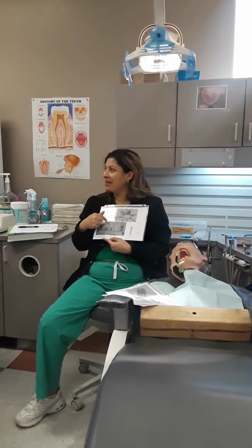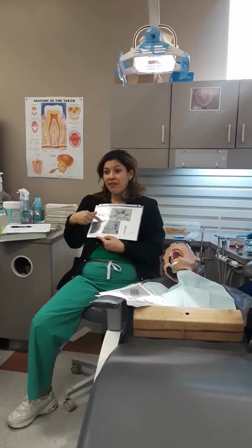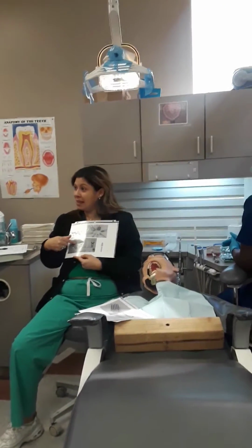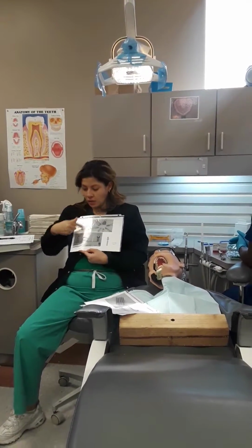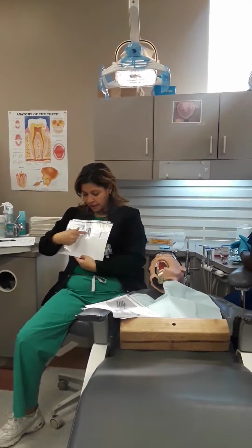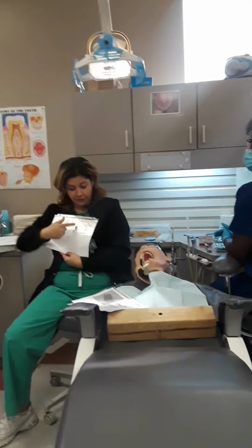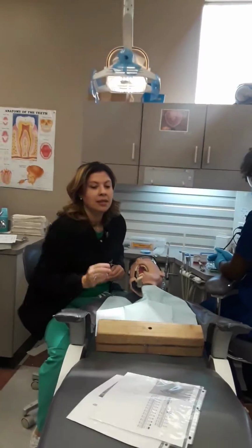polish the amalgam and make it smooth and slick, because if it was rough, then plaque and bacteria like to adhere to rough surfaces. So we would just place a filling that attracts plaque instead of not. So that's why we need these. Then I have examples of finishing strips. Also, again, different types of discs and mandrels. So you get them up close. I have a few pages of those.